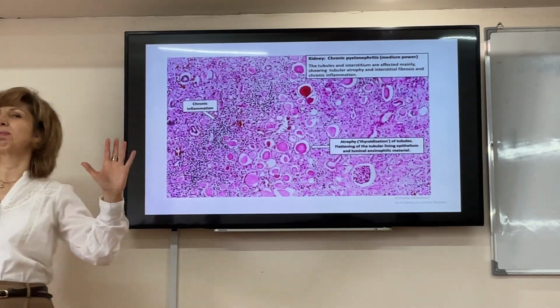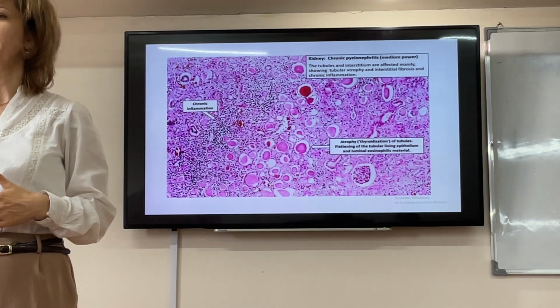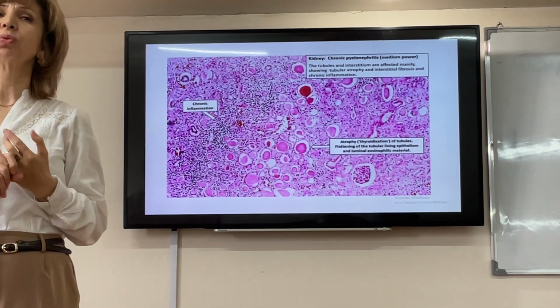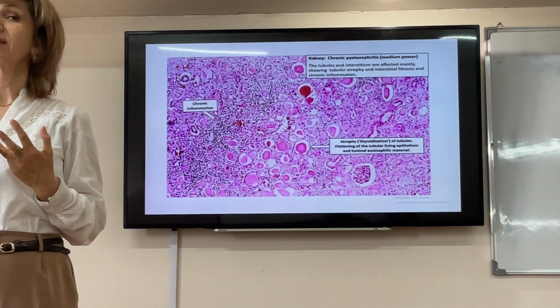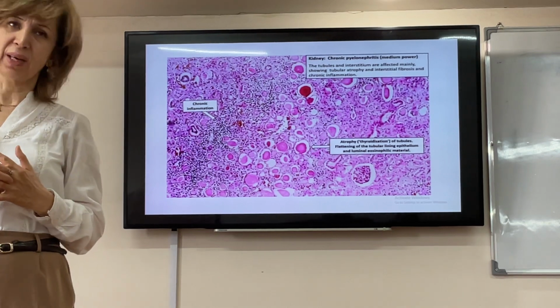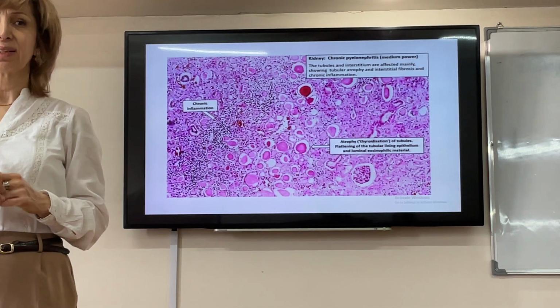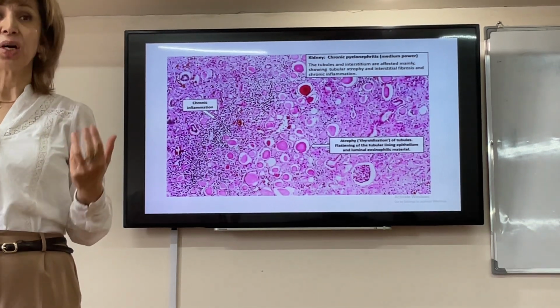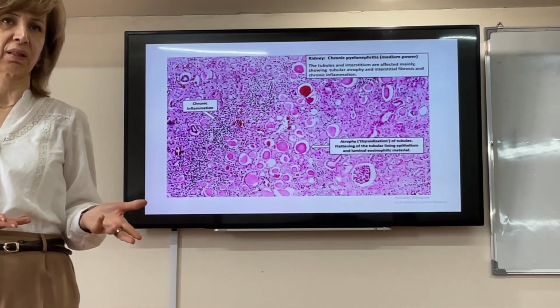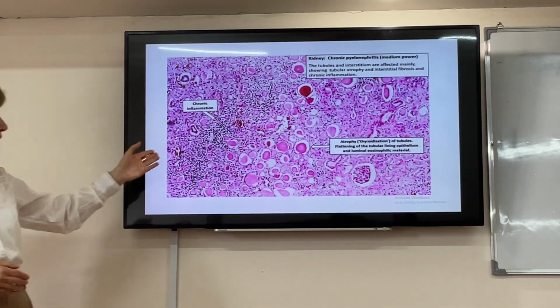So this is what? Chronic. What's the hallmark of chronic inflammation? Mononuclear cells. That's what you say. Number 2, tissue destruction. Number 3, fibrosis. I want these 1, 2, 3. Please don't forget fibrosis. In the test, everyone forgot fibrosis. These are the 3, because we studied regeneration from the beginning. So I will see fibroblasts in the chronic. Any questions?